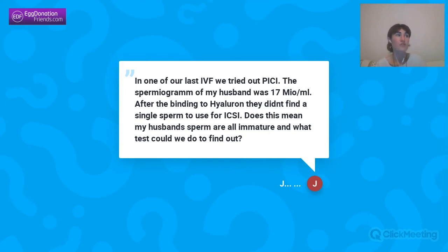They will have processed the sperm sample. They will have looked several times. But maybe when you're not expecting this, because it's very unusual, you did not prepare with enough time in advance. So it could be that, even though it's difficult, with more time in advance knowing this, it's possible to find some sperm cell which is mature.